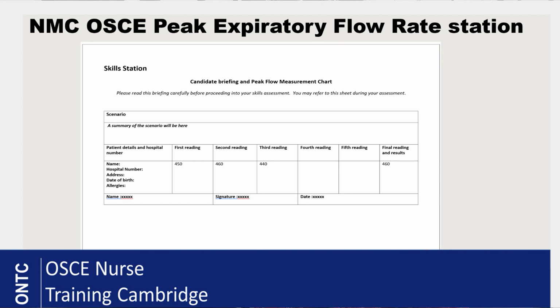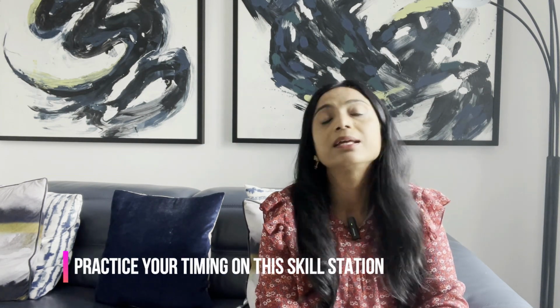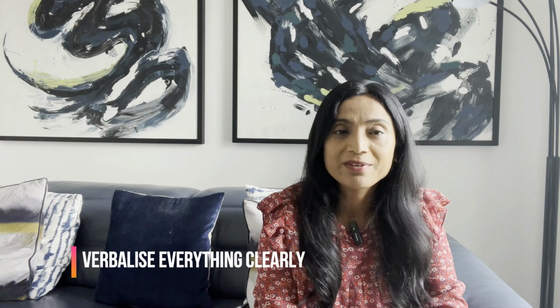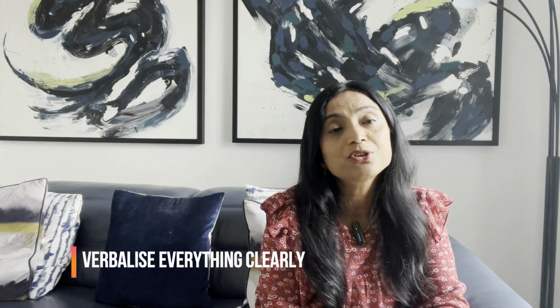So now my 5 top tips. So the top tips are, it is a quite quick station, 8 minutes does go very quickly, so make sure you practice with a timer. Top tip number 2, verbalize everything very, very clearly, because your mannequin can't do a reading, so your assessor is relying on you to do this procedure correctly. They're relying on your verbalization, okay?